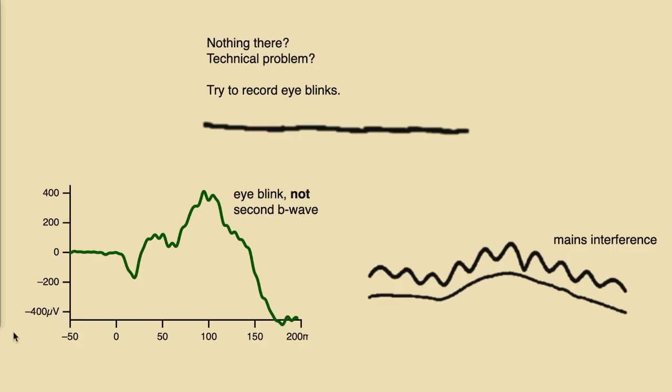And some people do eye blinks rather quickly after the flash comes, like a reflex basically. The eye tries to protect itself and doesn't like the flash, so it's doing an eye blink. And this is a moderately fast person in this respect.